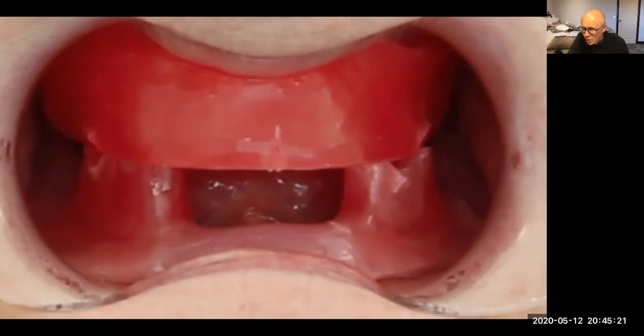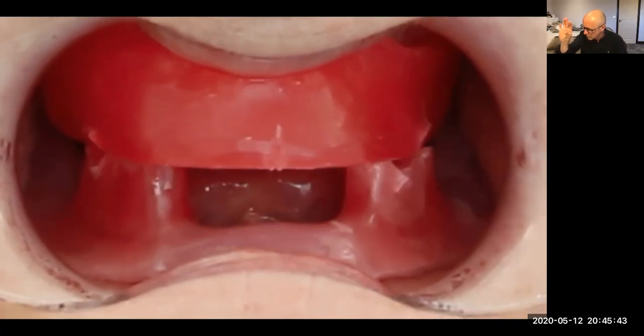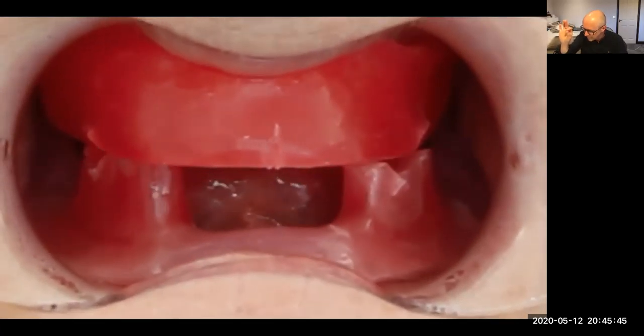Can't be fully certain because the Gothic arch tracing is really good for that, but this is the second best. And this is good if you work in a system where you can't afford to use the Gothic arch and it's too expensive, this is fine. So I want to double check everything's marrying up perfectly and it's stable.